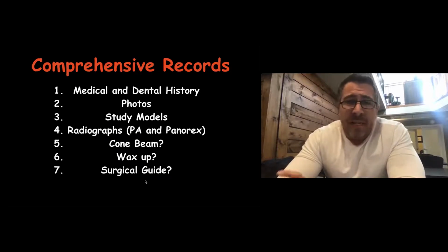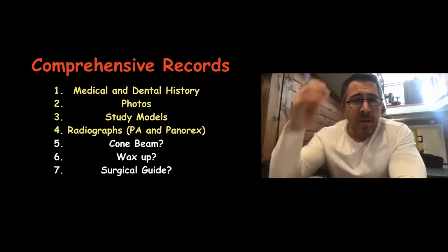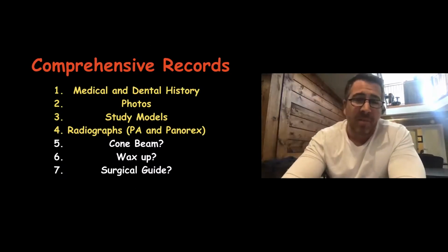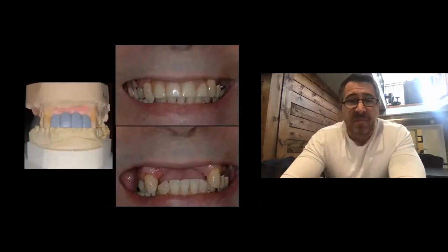Surgical guides, to me, again, I tend to incorporate more into comprehensive cases. I don't use them so much for single tooth cases because, going back to that concept of a puzzle, when I've got a lot of pieces that are giving me direction, I don't feel like I need to guide quite as much. But again, I think that comes down to experience. So medical history, photos, study models, and radiography to me are part of every single case. And whether or not you incorporate cone beam and surgical guides is your decision.